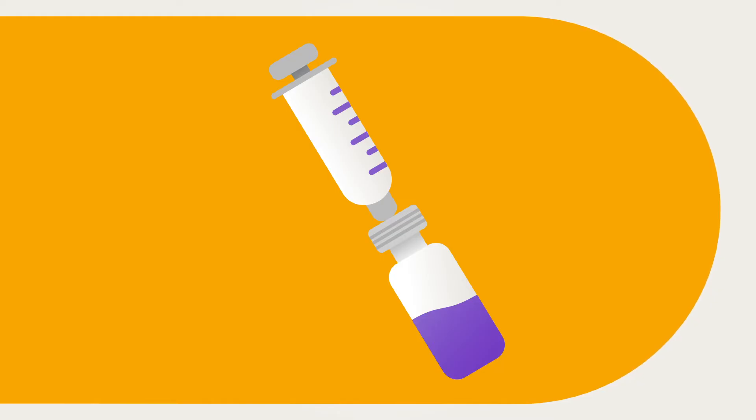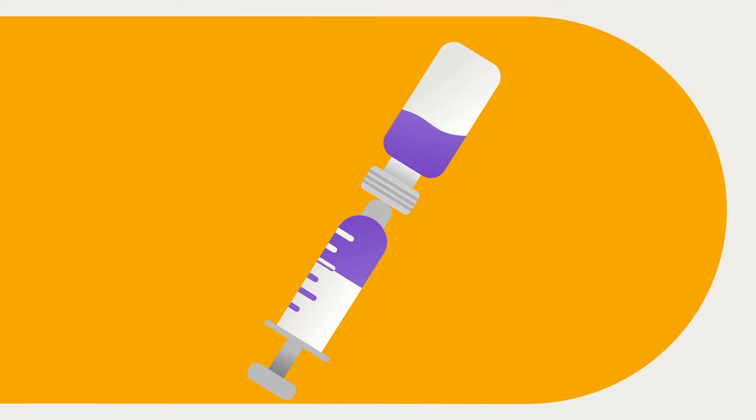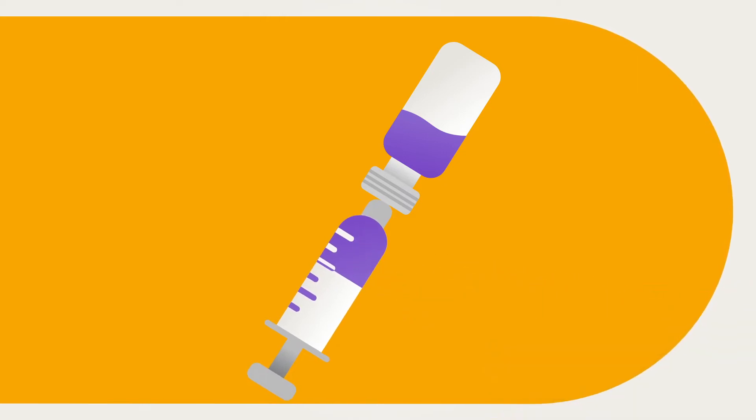Depress the air into the vial of insulin. With the needle still in the vial, turn the vial upside down and fill the syringe with the desired amount of insulin. To remove any air bubbles in the syringe, with the needle still in the vial, flick the side of the syringe to make them rise to the top. Carefully push any remaining air bubbles back into the vial, then remove the needle from the vial.